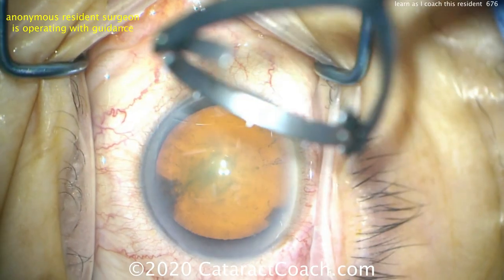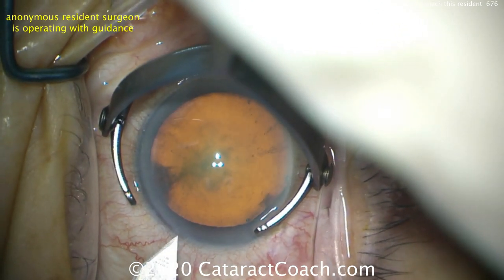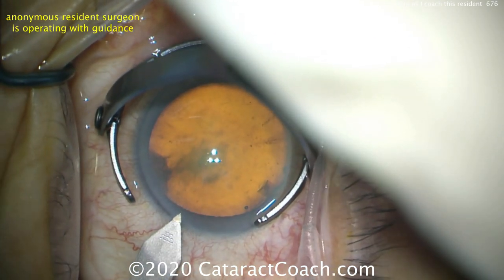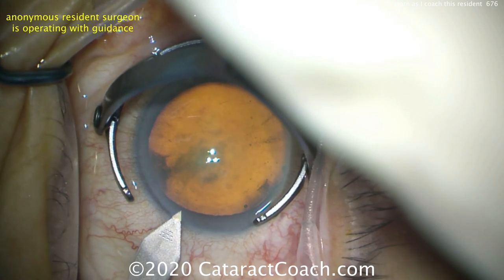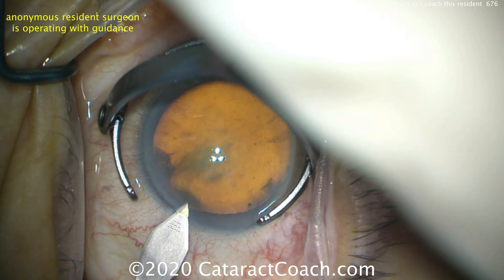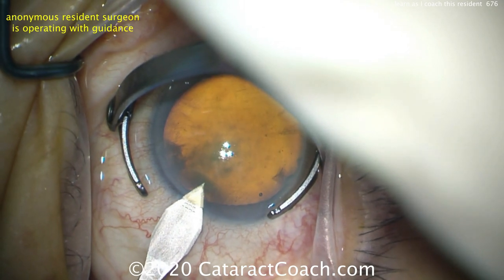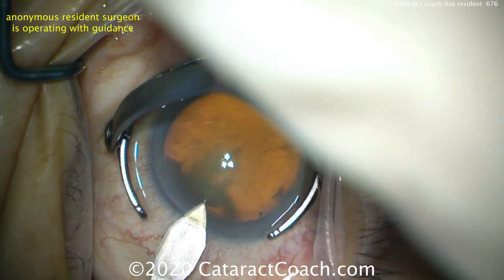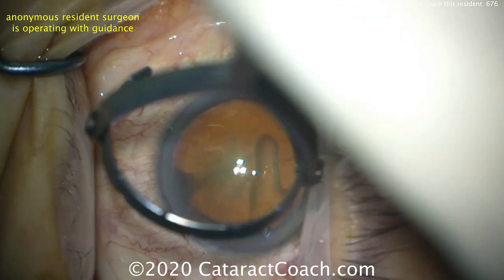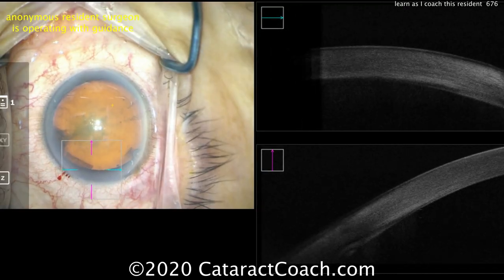Now get the tip of the blade up to go through the corneal stroma. Try that again — that's okay. Fixation ring again, parallel to the iris initially, right at the limbal vessels. Good. Now, toe up. Good. Advance it slowly, keeping the blade totally flat. There should barely be any space between the blade and the conjunctiva. Advance it, keeping that angle constant — that looks great. Once you have the appropriate tunnel length, a little bit more — now go back parallel to the iris, go straight in and come right out. Beautiful incision. Great job. That incision has very nice architecture.